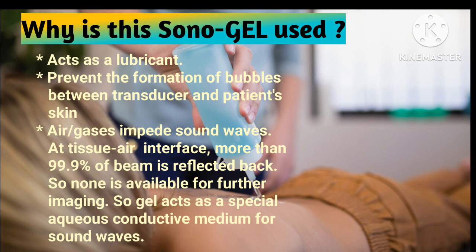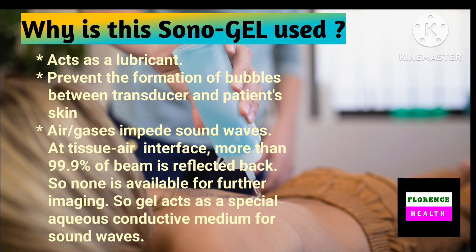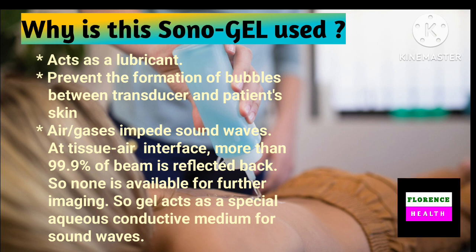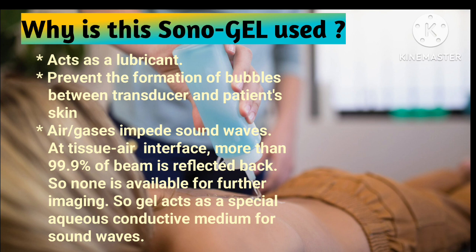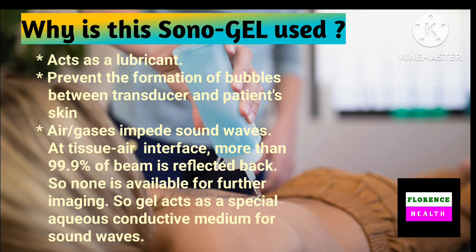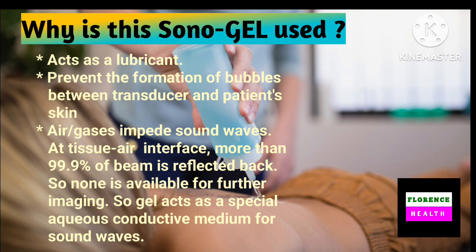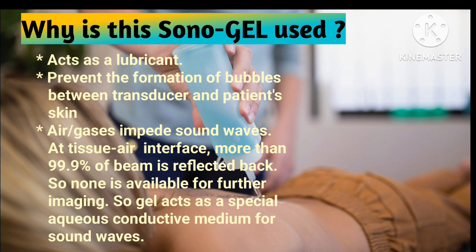At last we will discuss why it is used. First point, it acts as a lubricant. Second point, it prevents bubble formation between the interface of transducer and patient skin. Third one, as I have already told, air is not sono-friendly. Air reflects back all the beam to the transducer. That's why no beam will be present for further imaging. So gel acts as a special acoustic conducting medium for sound wave.